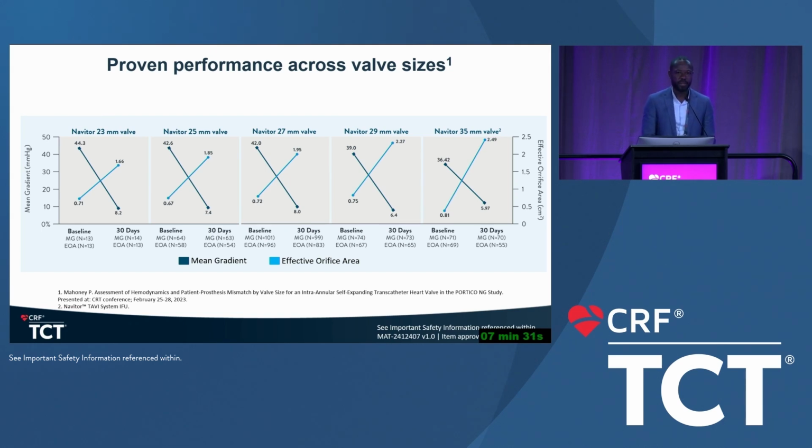So guys, what we have discussed is the importance of the heart team discussion, and I think we truly have a heart team today, and it's nice to share this type of comments with you guys. So we understand how important it is to discuss the patient and the anatomy of the patient, the risk of patient prosthesis mismatch or bad hemodynamics, to route for an adequate surgical procedure if you think that the patient is still a surgical candidate, and root enlargement has to be taught, has to be learned. But we have at the same time quite exceptional TAVI platforms today that achieve very good hemodynamics, so it has to be integrated into the equation, as well as the risk of coronary access, pacemaker risk.